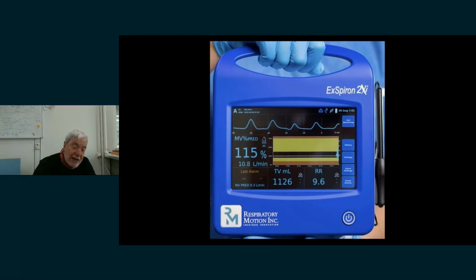You know, personally, when somebody calls me about a patient in a very terrible situation, I don't ask first how much is the FiO2 and how much is the PO2. Remember, the status of the lung is far more defined by the CO2 clearance. So I ask how much is the PCO2, and at which minute ventilation it is measured.